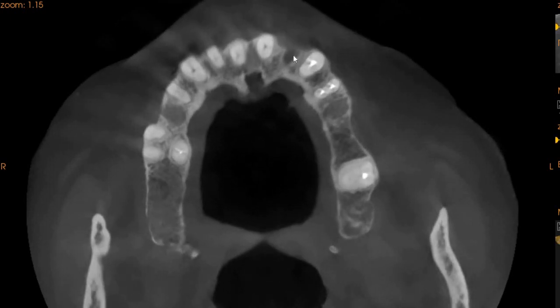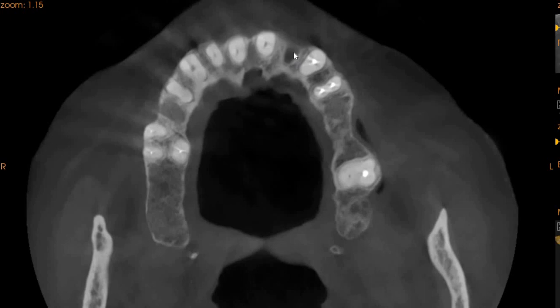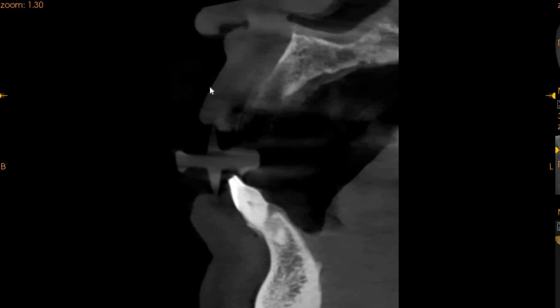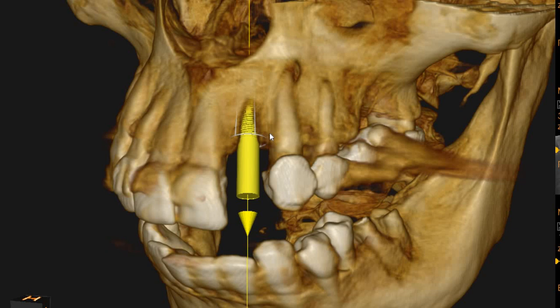We don't have any periapical pathologies or any pathologies associated with this region. For implant placement, the doctor has requested a Neobiotech implant, which we will now place. The Neobiotech implant selected is a 3.8 by 11.5. We have taken 11.5 so that the maximum amount of bone can be integrated and involved at the apical region where the implant is placed.